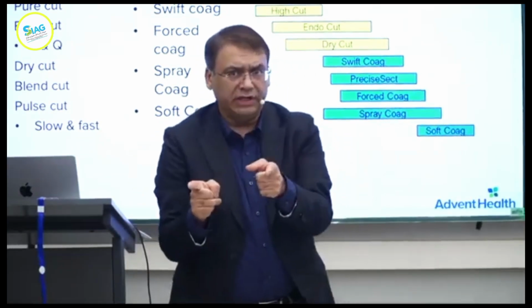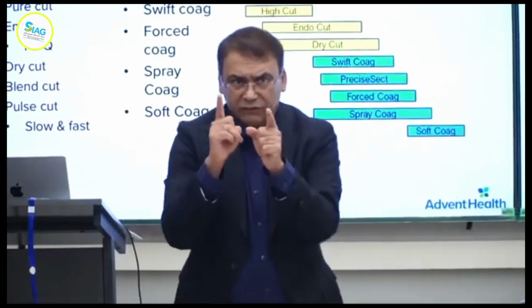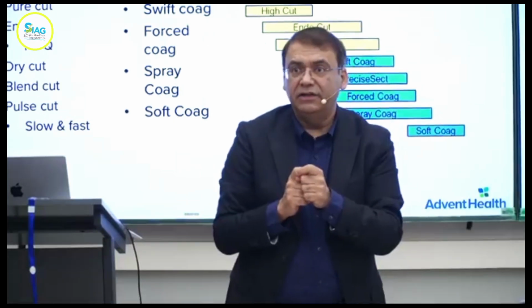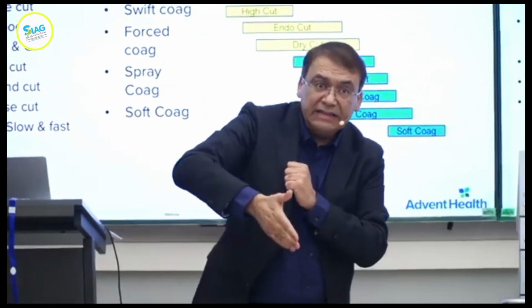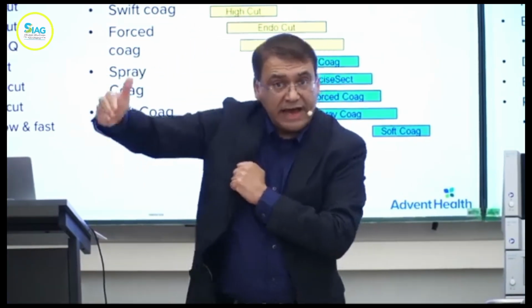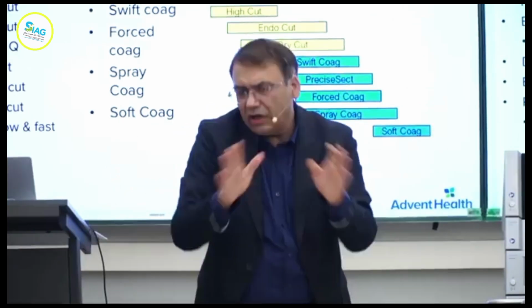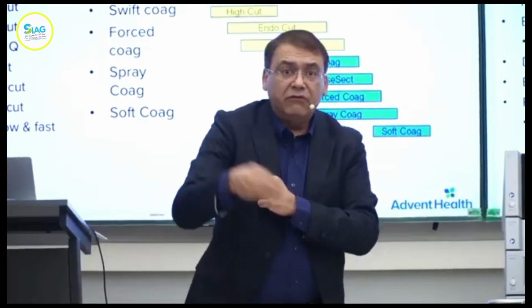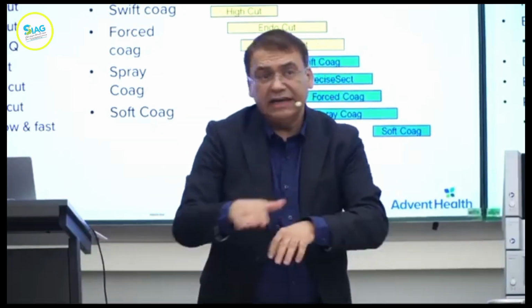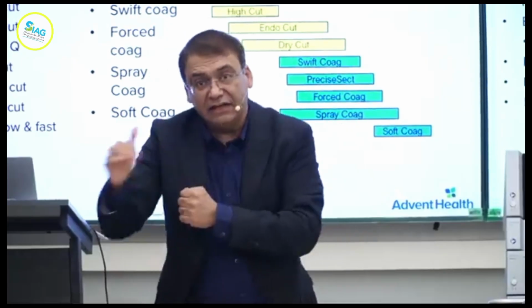Yesterday we did a sphincterotomy. It started bleeding, right? Why did it start bleeding? Because when we were doing the sphincterotomy, we were tapping it, not letting the whole cycle of endocut go. Because tap is cut. There's no coag in there. So we do that all the time. And for snare, we put our foot on the paddle and let it keep going because we want it to coagulate. So let the cycle complete.